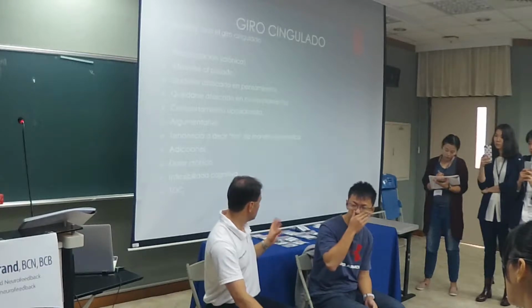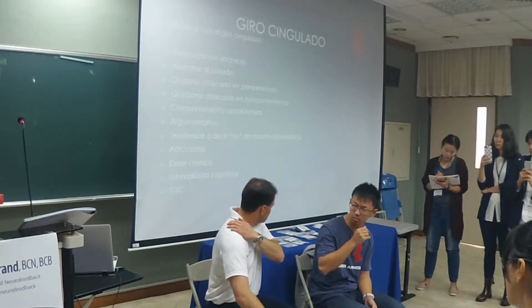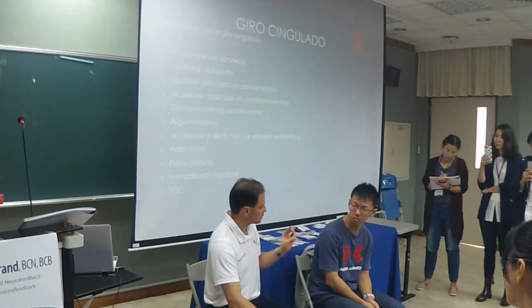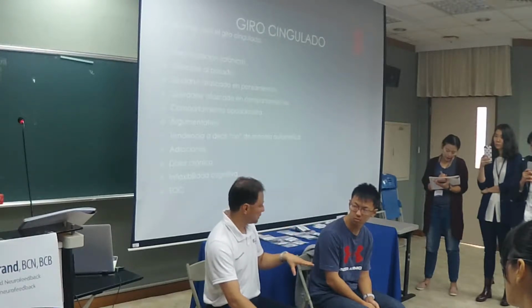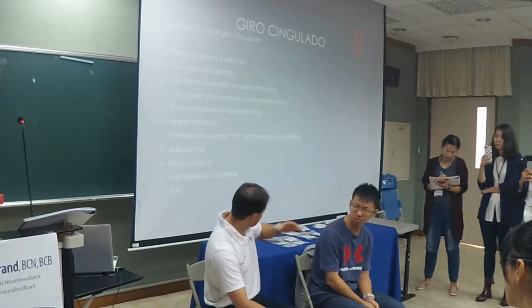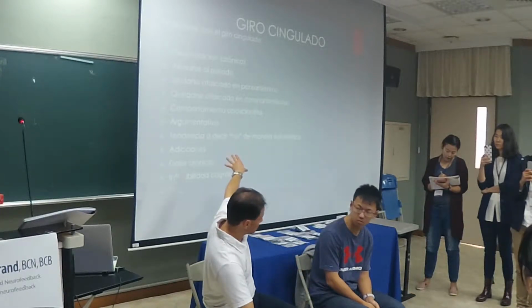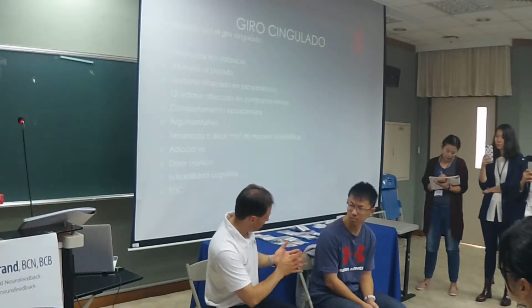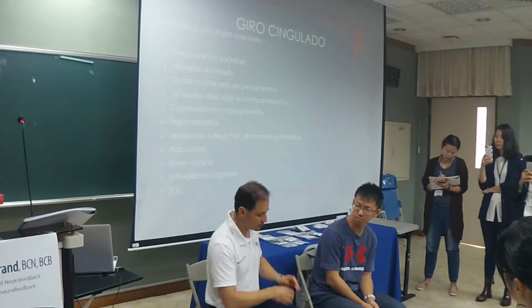So I'm going to do a series of procedures. I'm going to be placing some sensors on you. Nothing hurts. Nothing's supposed to pinch or burn or anything. Nothing's going into your body. Everything that we put on is going to record and send it to the screen so we can watch it and see it. All right. So do I have your permission to put things on you? Yeah. Okay, great.